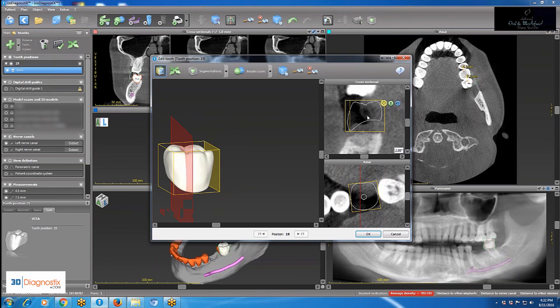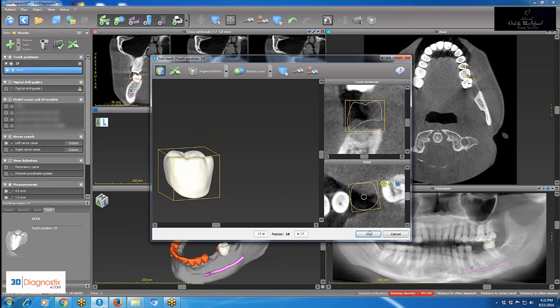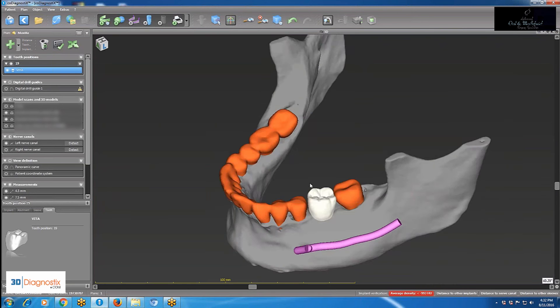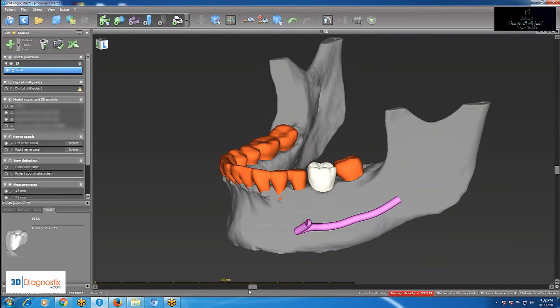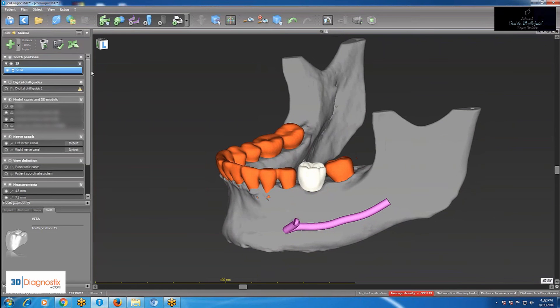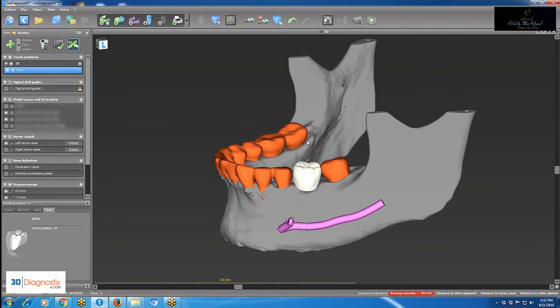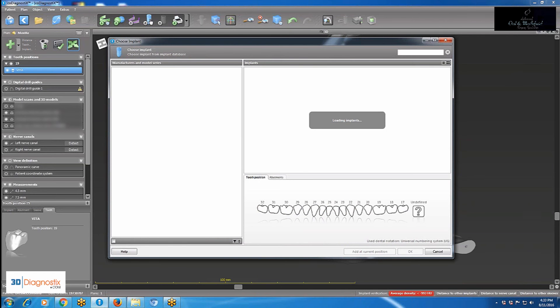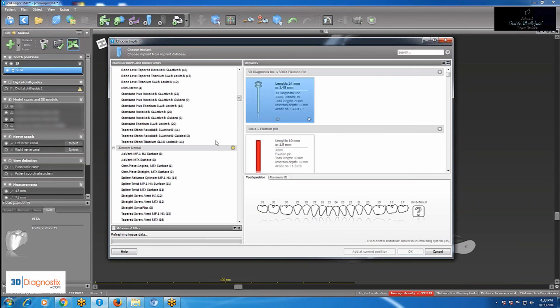click OK and view it in the 3D view. I can still tweak it from this view by right-clicking to change the angulation, or left-click and hold to change the position, placing it in the most perfect position in relation to the adjacent teeth.